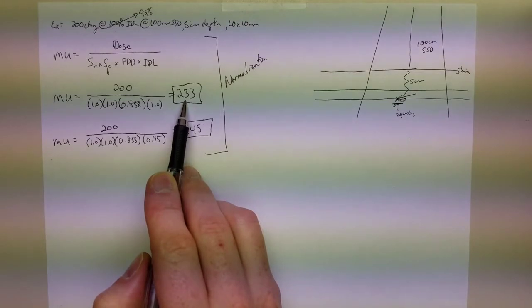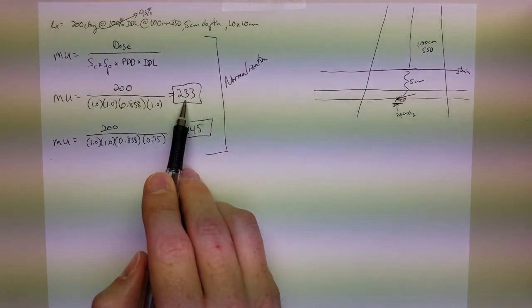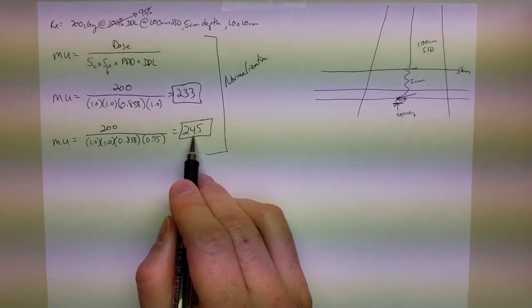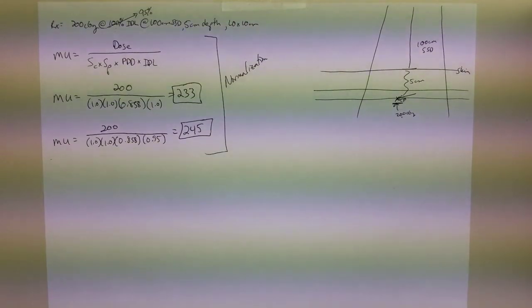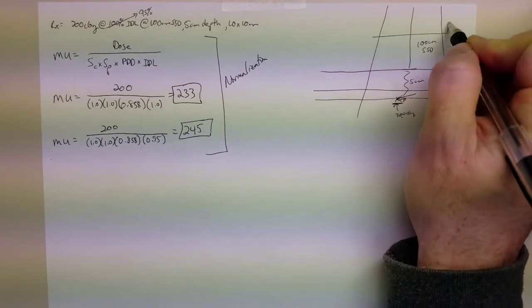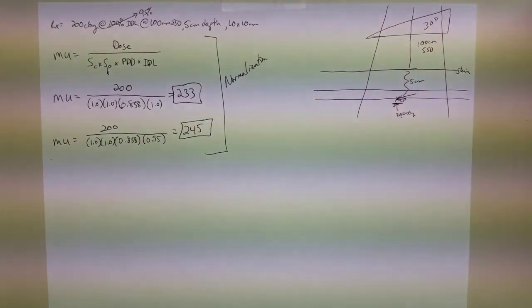units. We went back and said, well, now the doc wants to normalize 5% down, so he wants to normalize to the 95% isodose line for increased target coverage. Our monitor units changed to 245 MU. Well, now, based on the treatment plan, the dosimetrist needs to insert a wedge into the field. So let's say we insert a 30-degree wedge into our treatment field.